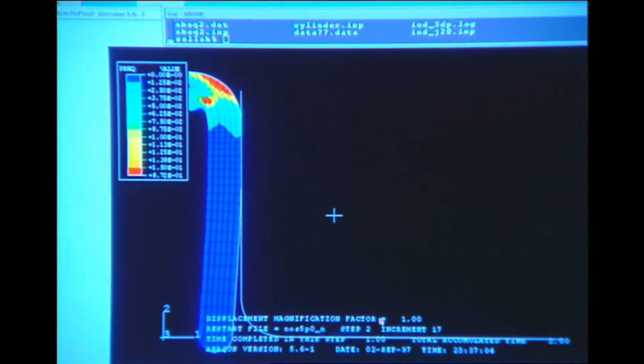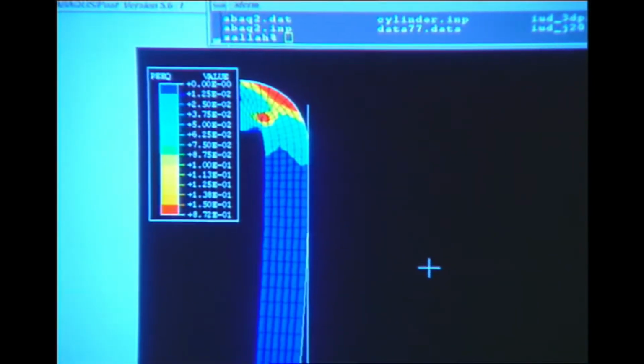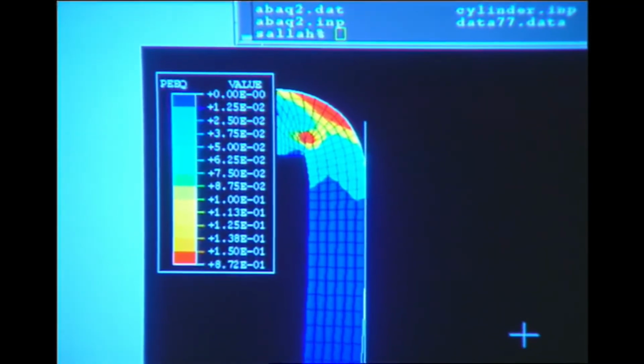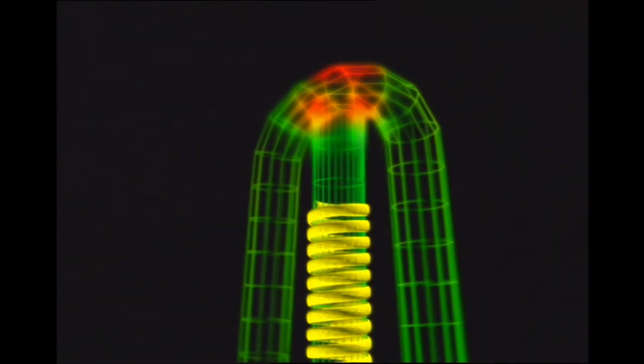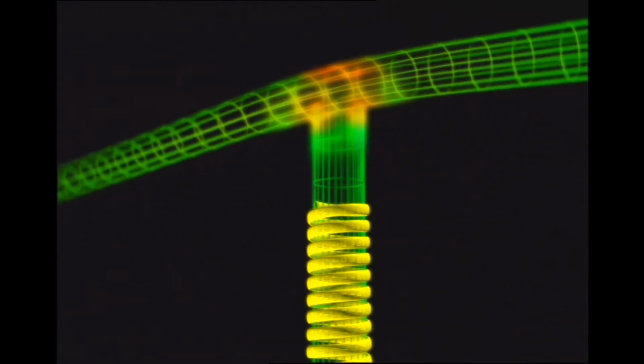Advanced finite element modeling studies have generated a detailed understanding of the stresses and strains within a T as it is flexed. This minimizes the strain on a T during the insertion process. Reduction of forward strain during insertion improves the retentive memory of the T.